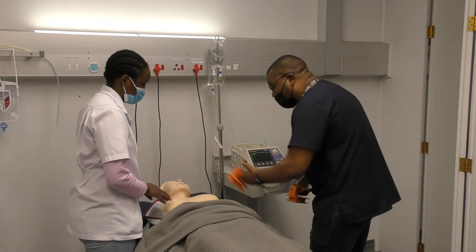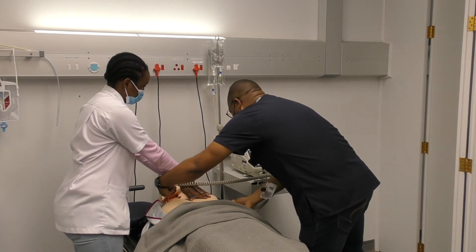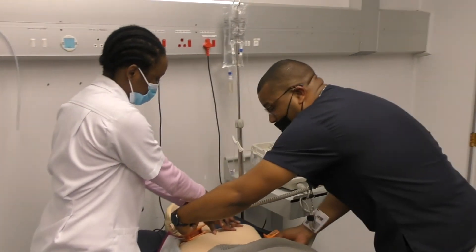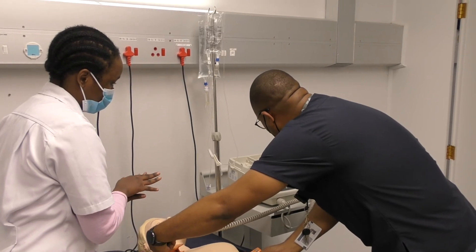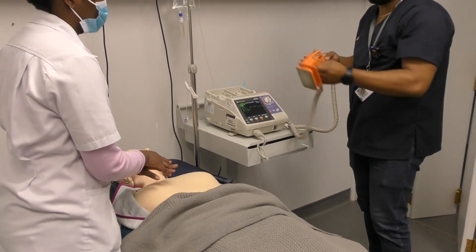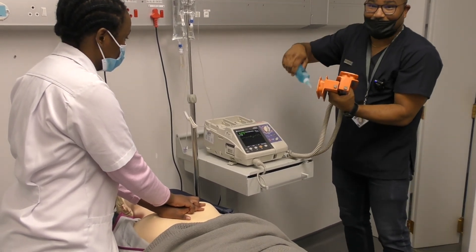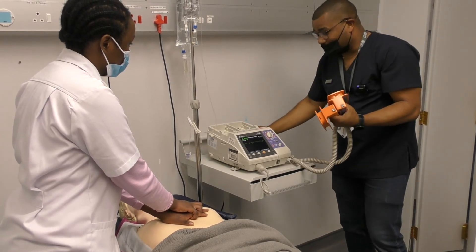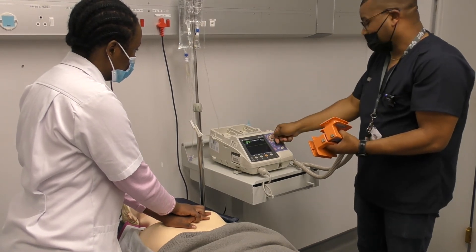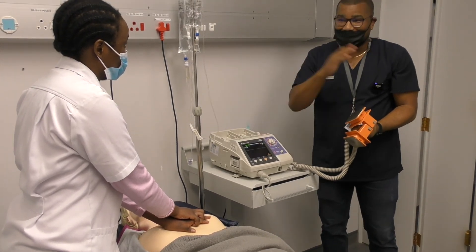While your colleague is performing chest compressions, you go to the defibrillator. As you were taught, you first switch it on to monitor mode to analyze whether the patient has a shockable rhythm. You use the paddles to analyze — placement is important. With compressions continuing, you say 'just stop quickly,' analyze, and confirm it's ventricular fibrillation. You then ask her to resume chest compressions, and now you apply gel to your paddles, then go back and set your joules on the machine.